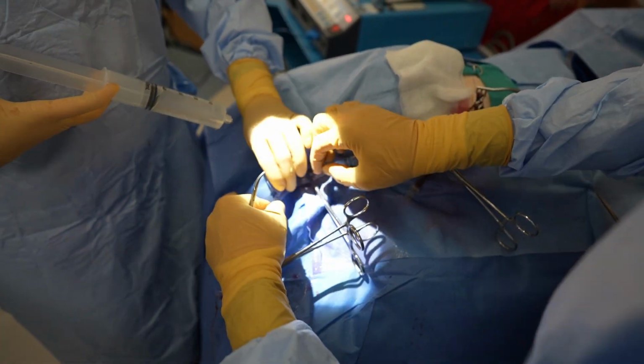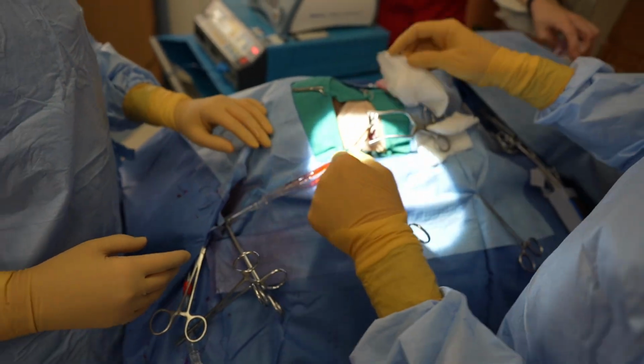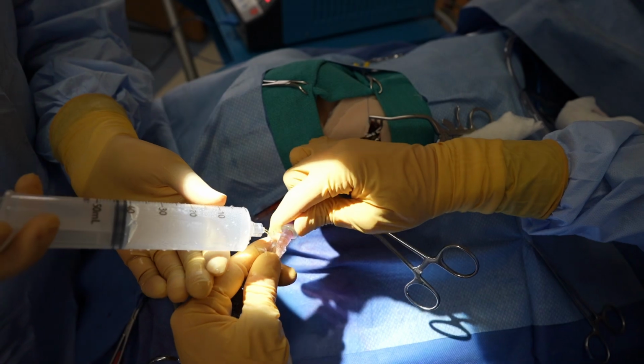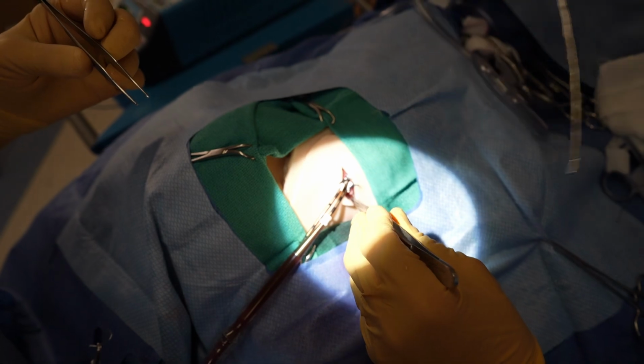We then snap the tubing to the drape in order to help keep it in place while we connect the other cannula to our circuit tubing. Again, we use a saline flush to get all of the air out of the connection and check for bubbles before we finally advance the tubing onto the cannula.